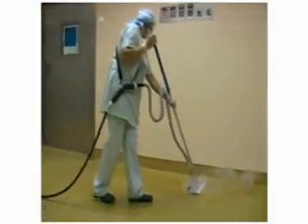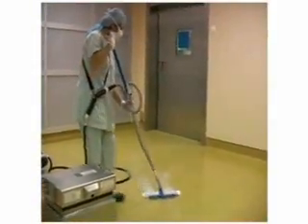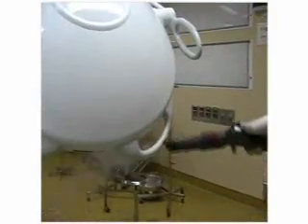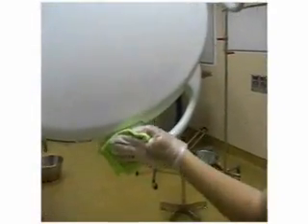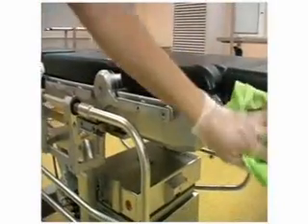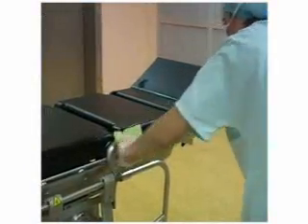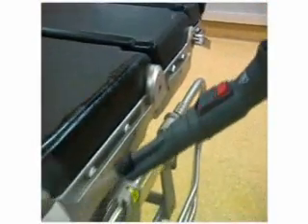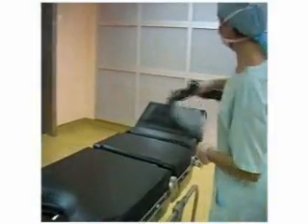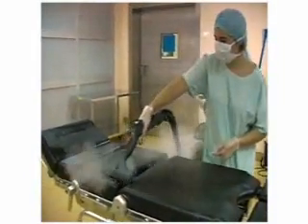At the end of every operation, the room is totally emptied of all medical devices, and the floor is treated with the steam brush. At the end of the day, the cleaning is thorough and complete. The basic rule to be applied is to go from the cleanest to the least clean areas, from the top to the bottom. The operator of the appliance must pay special attention to the operating table with its hard-to-reach zones and clean these using the different accessories provided with the steam generator.